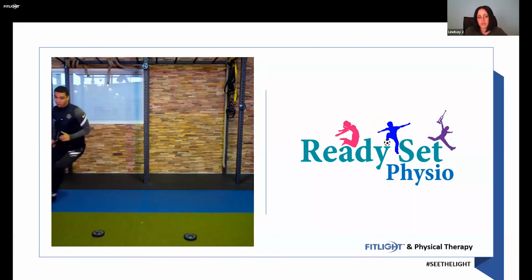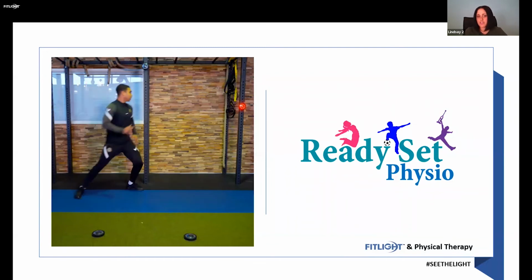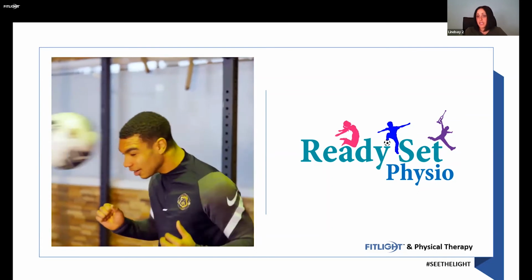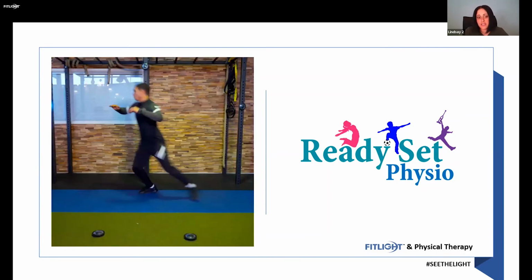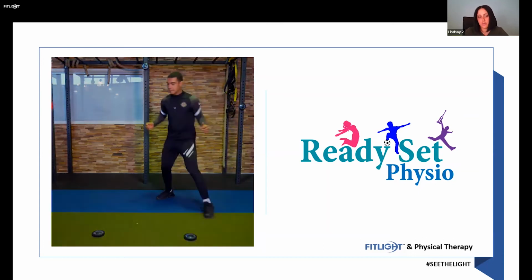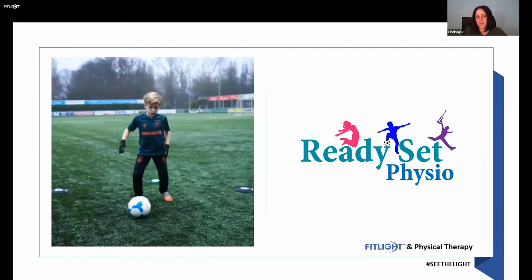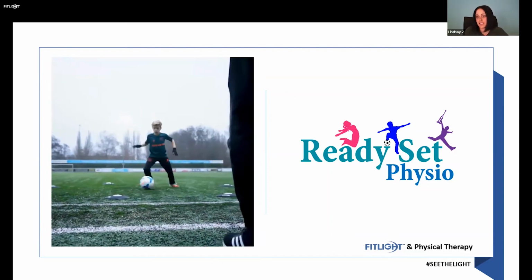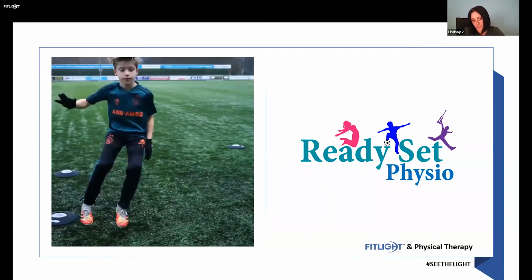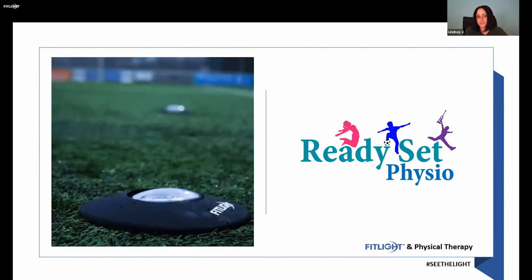After they've got their complete range of motion, their strength is back, and everything else looks good, we want to move into more sport specific drills, and how can we mimic that in a setting using the lights. These are great examples of that. The other thing I like is that you can use the lights outside or inside. Because I'm a home therapist, I might take it to a kid's backyard or the driveway and set something up, or take it inside the house. So having the ability to do that is key as well. All right, great.